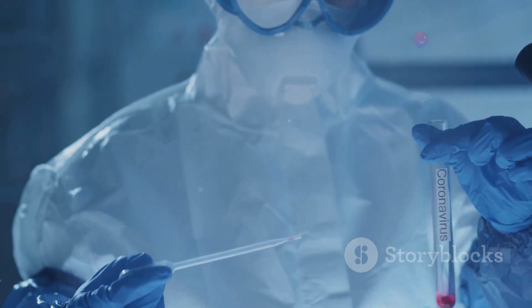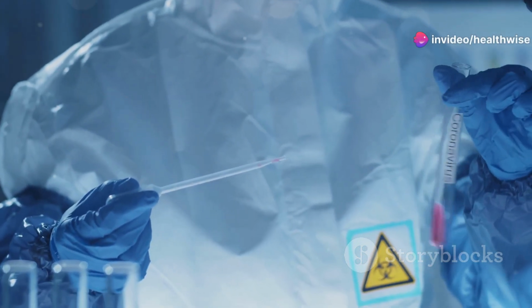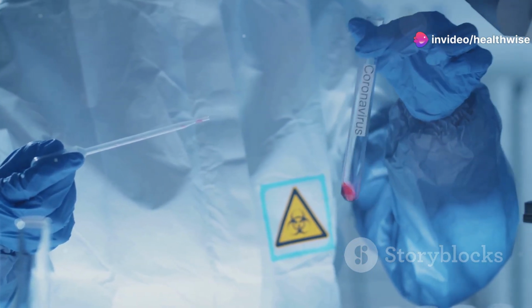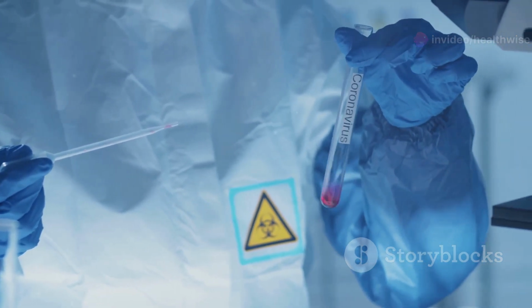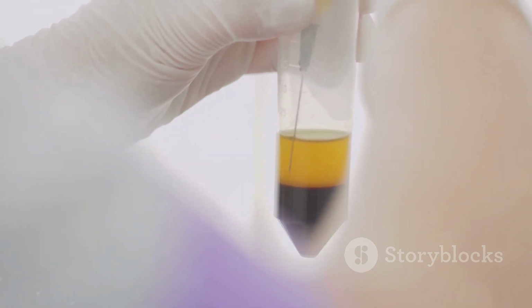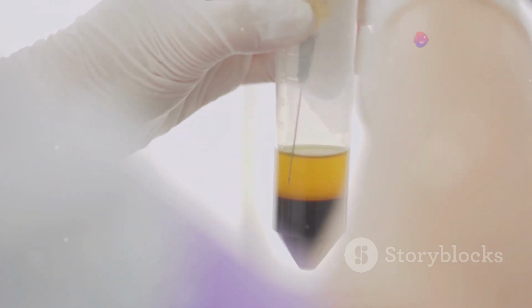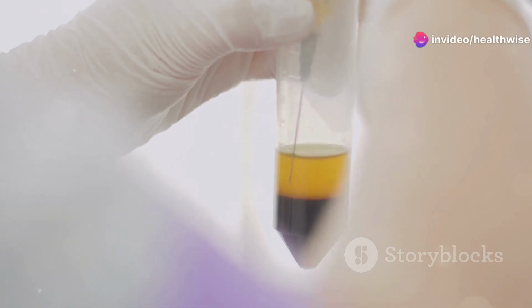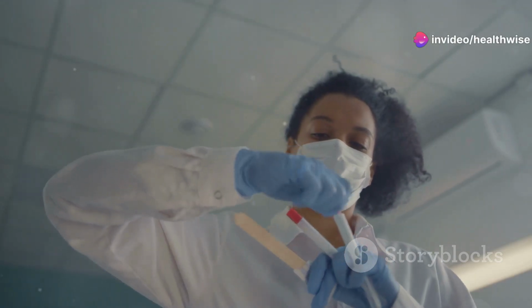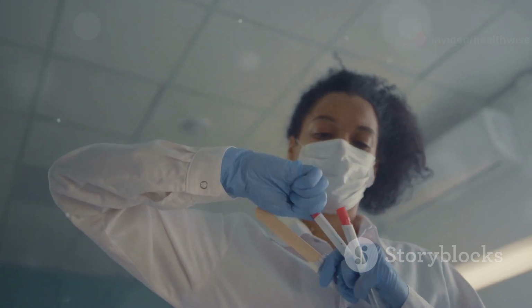Gastric washings are best collected early in the morning while the patient is in a fasting state. This ensures that the stomach contents are minimal and the sample is more concentrated. Right after collection, these washings need to be neutralized using N/10 NaOH. This step is crucial to prevent the sample from degrading and to preserve the sample's integrity. Without this step, the sample might not be usable for testing.